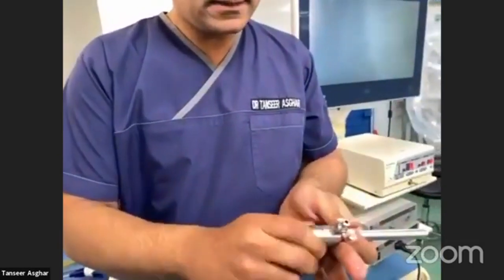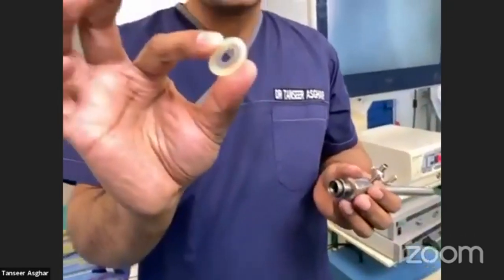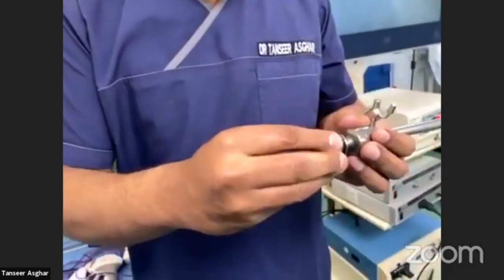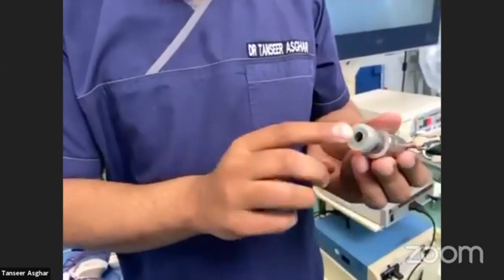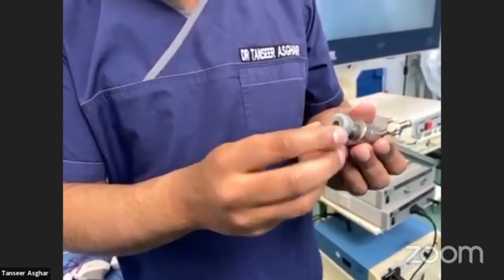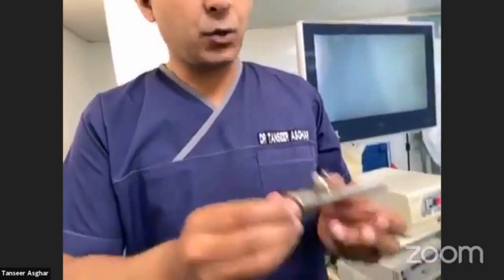There is a plastic-type sleeve over the cannula which must be in good condition — it should not be cut or torn. If it is damaged, there will be low pressure in the abdomen, making it very difficult to operate.